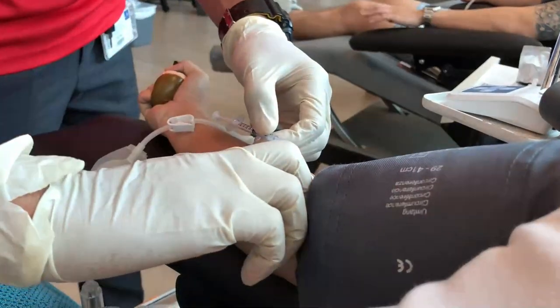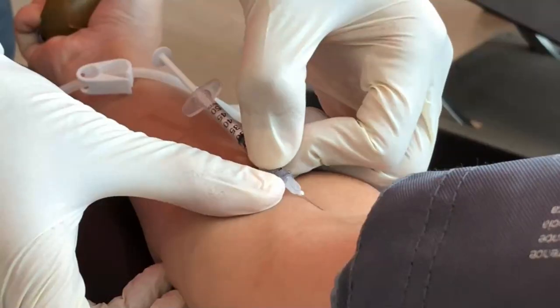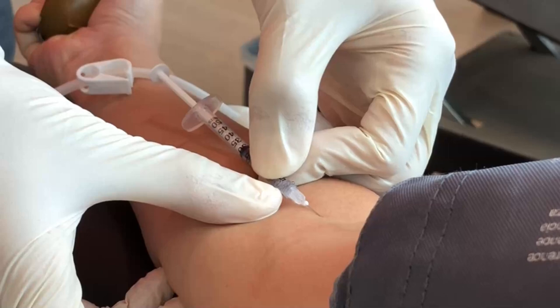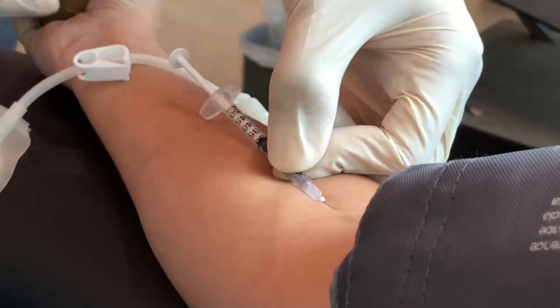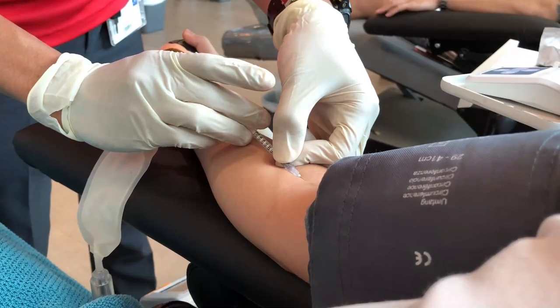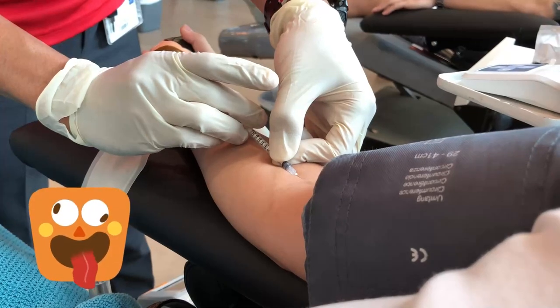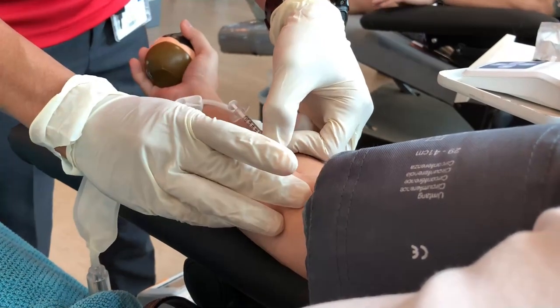This is where you start to freak out a little bit. It's a little bit scary if you're afraid of needles, but it is in. He has put it in and he's pressing on the syringe a little bit. I don't know if this makes you a little bit woozy, but he is squeezing out, and he's done.